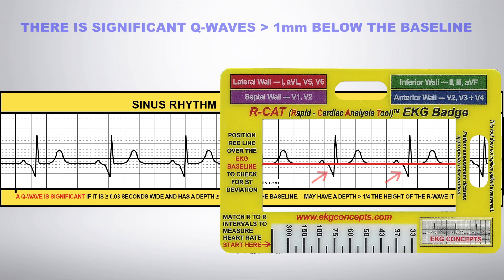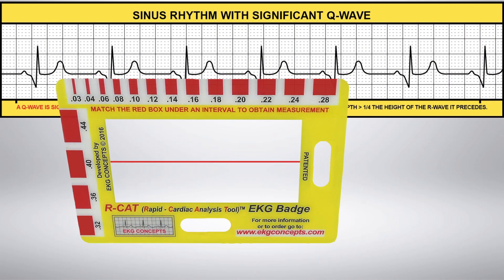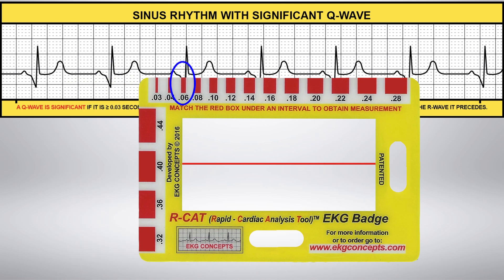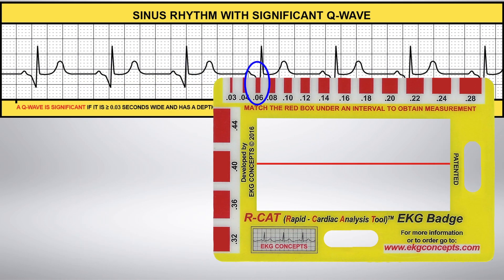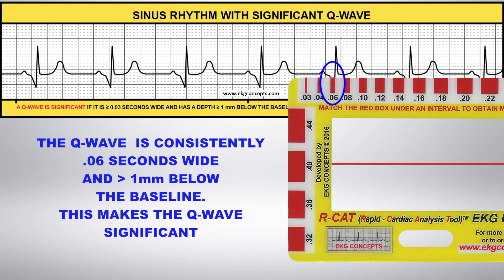Now flip the badge over and use the calibrated red boxes to measure the width of the Q wave. Here you see the Q wave is consistently .06 seconds wide, which is greater than the norm of .03 seconds wide.